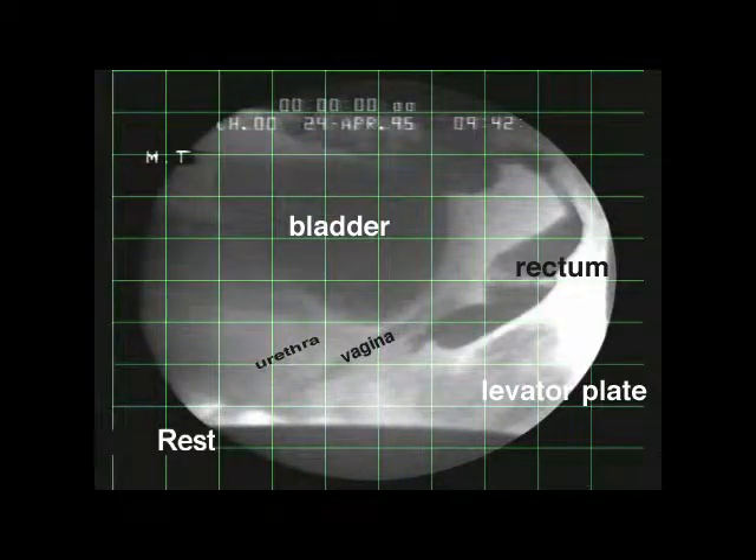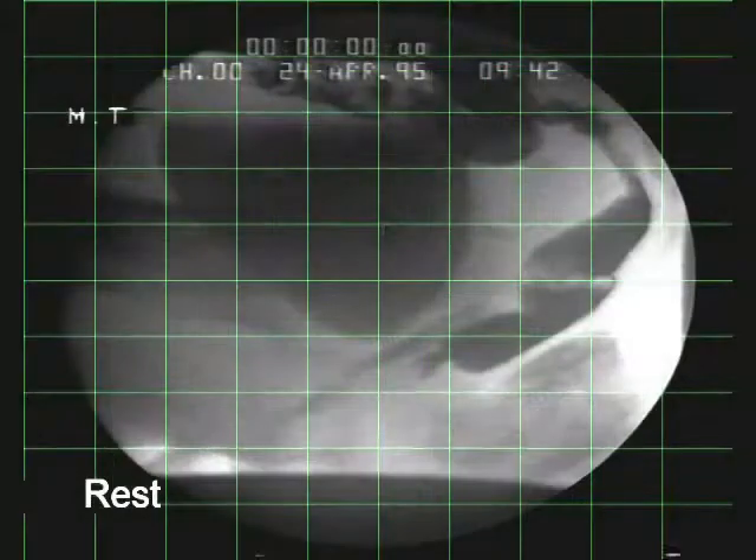This is a micturition video in the sitting position. Radio-opaque dye has been inserted into the bladder, vagina, rectum, and levator plate.